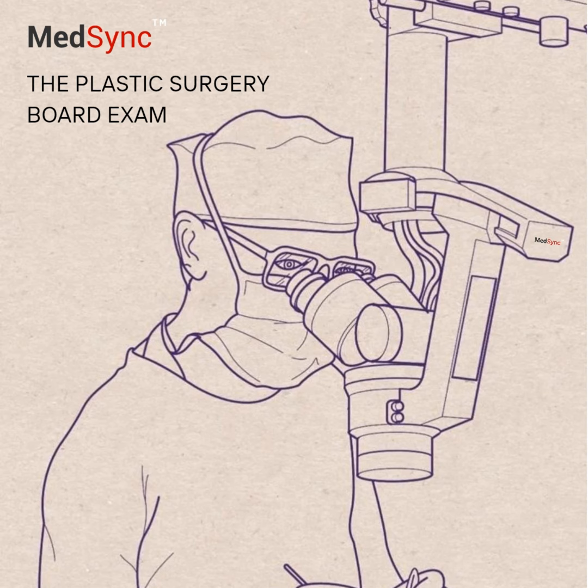There are different approaches, non-ablative and ablative. Correct. Non-ablative resurfacing heats the dermis and/or epidermis to stimulate healing without removing tissue layers. Ablative lasers actually vaporize tissue layers. Examples of ablative lasers: CO2 at 10,600nm and erbium:YAG at 2,940nm are the main ones. There's also fractional resurfacing, which creates microscopic columns of ablation or coagulation, leaving surrounding skin intact.